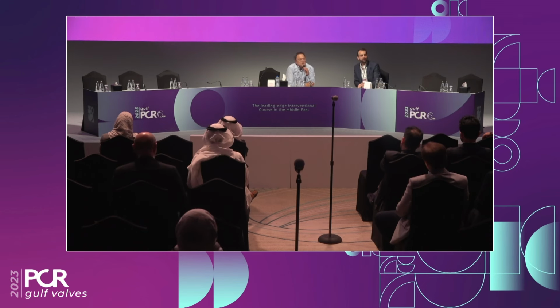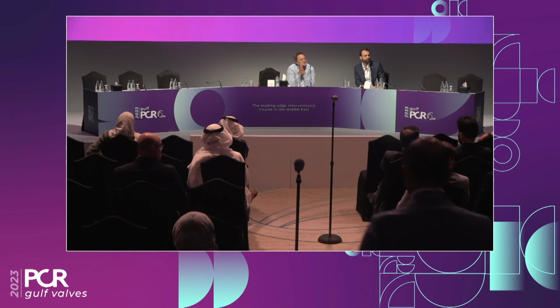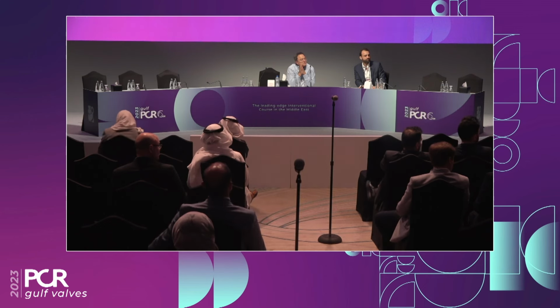Any comment? Any question? Ziad, we've been using the Navitor. What's your experience with this valve? I think really the flexibility is the most impressive part. The first case that you showed is a perfect example of where it can track very well. You can position it well, and the system is very easy to use. It's very user-friendly. I'm usually on the system side. Fadi is on the deployment.